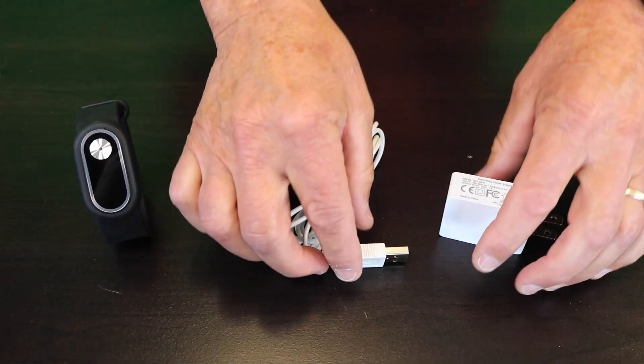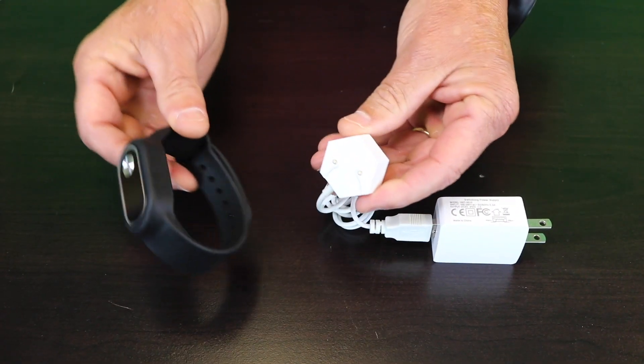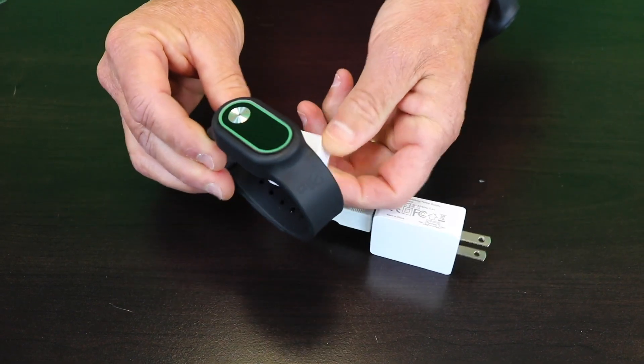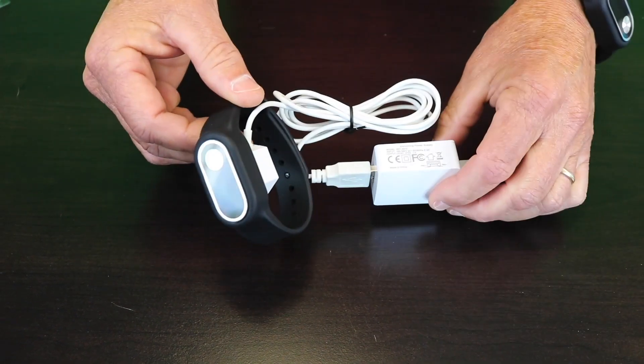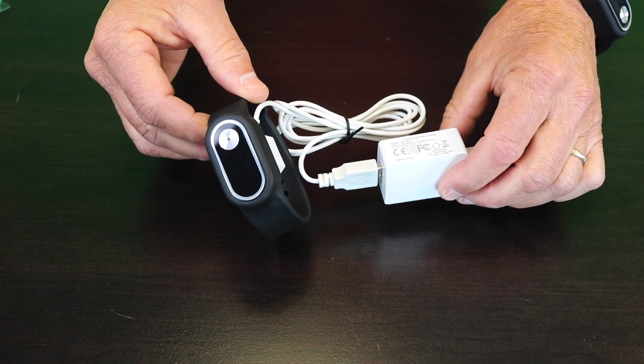To use the band, simply connect the charging cord to the plug, plug into a wall, and then connect the charger to the back of the band. The blue light will flash, and when it stops flashing, you're ready to go — that generally takes about two hours.